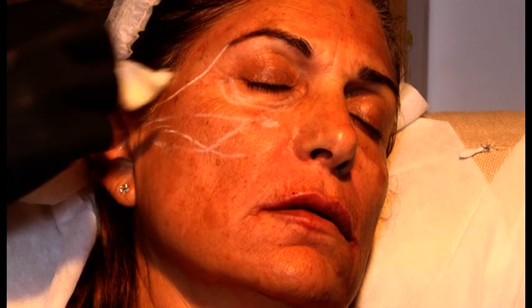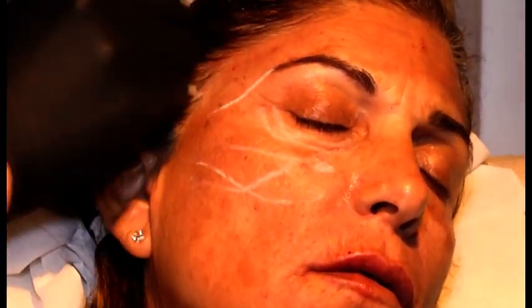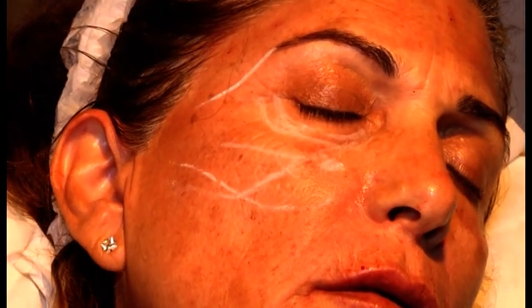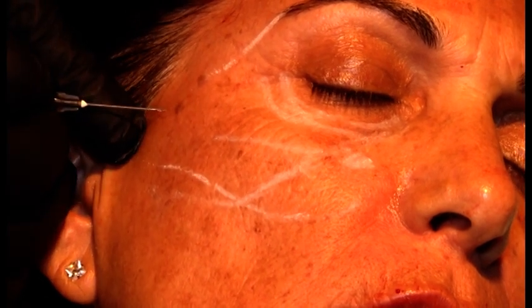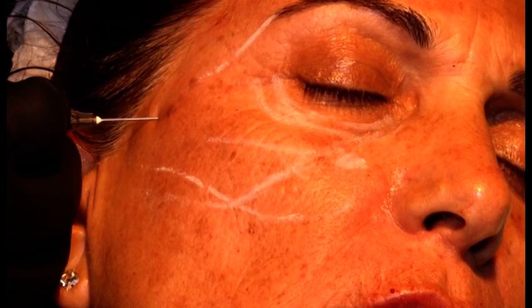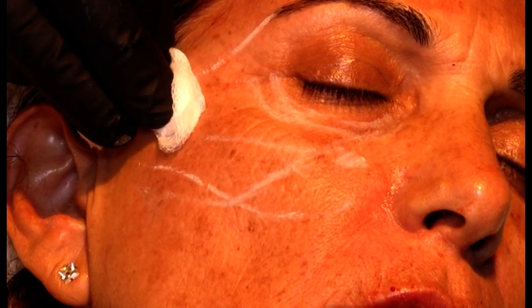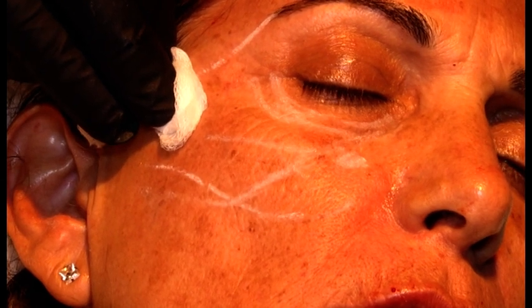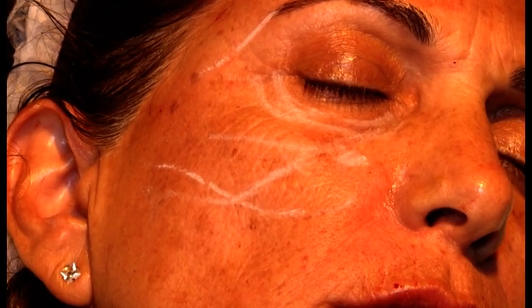So what I'll do is I'll make her hair completely wet because I like wet hair. And I start from the top of the zygomatic arch. And I will have a 23 gauge cannula. This is actually nicer to use a 22 gauge needle to make a pre-hole for the 23 gauge cannula.